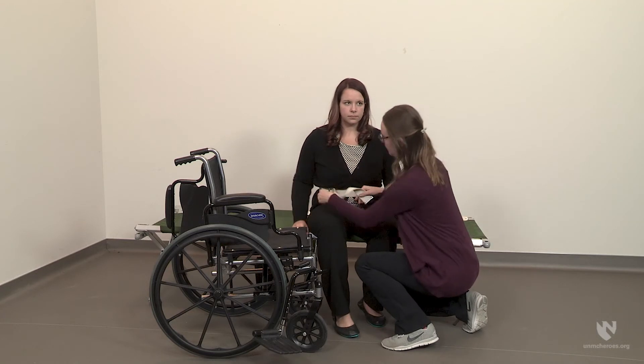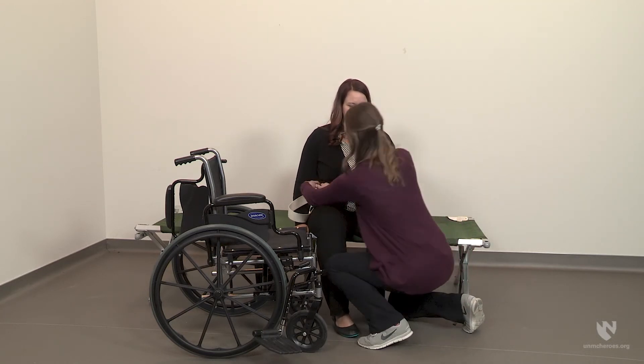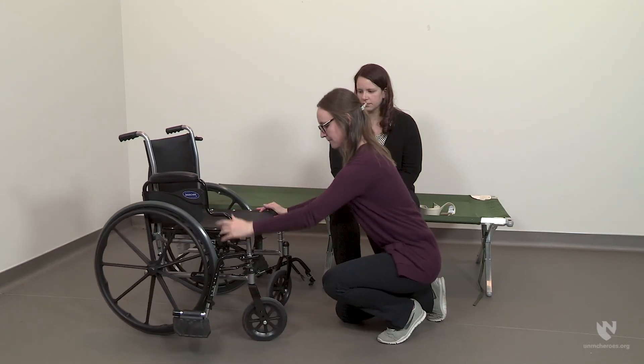Remember to bend with your hips and knees and maintain the natural curves in your back while performing this transfer, especially given the low height of the cot. Once the individual is on the cot, remove the gait belt and check to make sure she is comfortable. Finally, replace the footrest and armrest on the wheelchair.